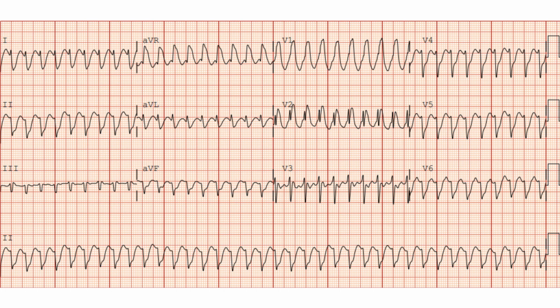So we sedated him. There are many different options for sedation. For me, for electrical cardioversion, I like propofol because it's fast on, fast off, and you don't have to have these patients all the way knocked out. So we gave him 60 milligrams of propofol.